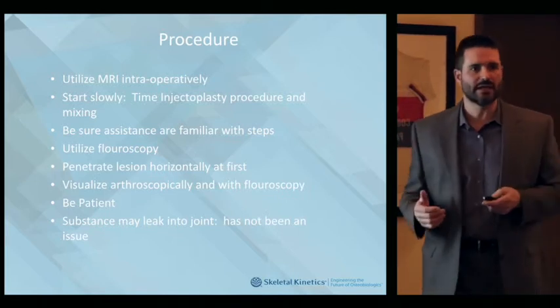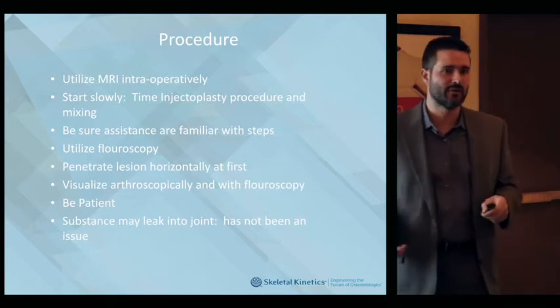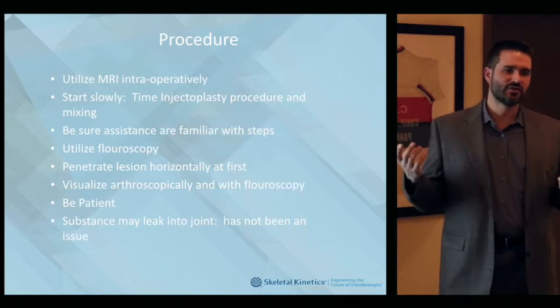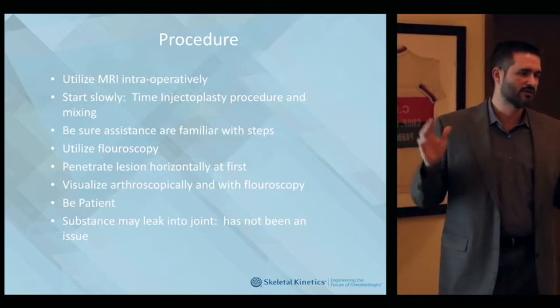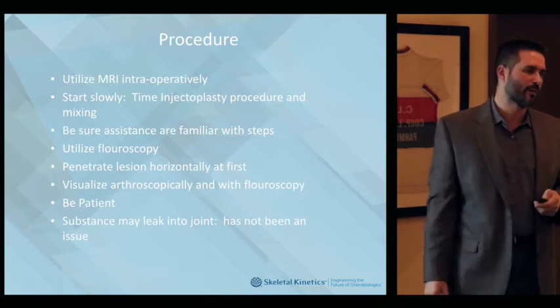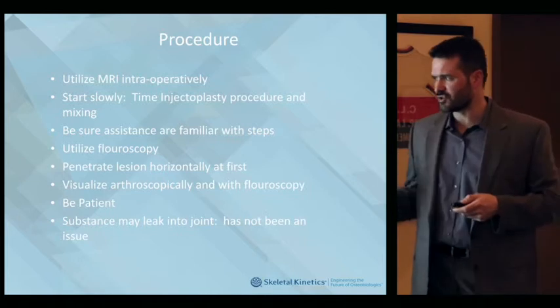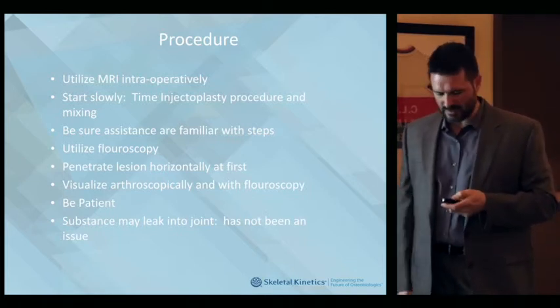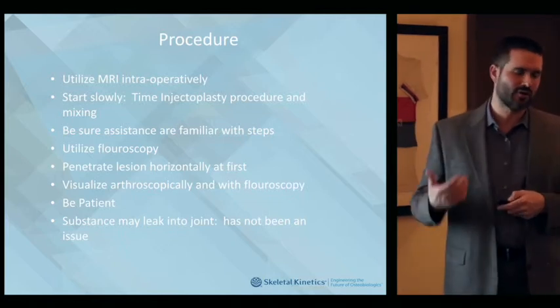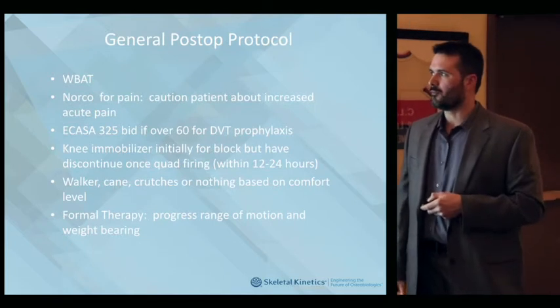They're walking on it. One guy just did a couple weeks ago, he had a bad fissure. I mean, a lot of it was coming in, but you could see it fill that void. He came in 2 weeks after, no pain, ready to go back to work. He's like, I gotta get back to work. I'm having no pain. 0 pain from not even able to weight bear for a month. Be patient as you're starting it, and like I said, if they leak into the joint, clean it out. I've had no issues. I get an X-ray after a couple weeks when they come back just to make sure. On those patients, I've had no problems.